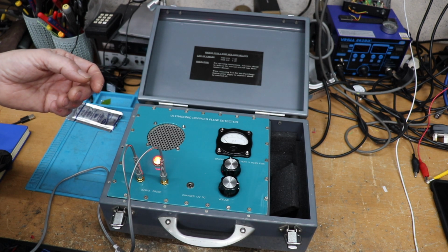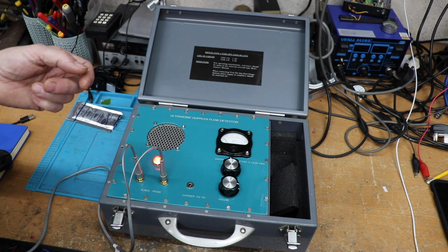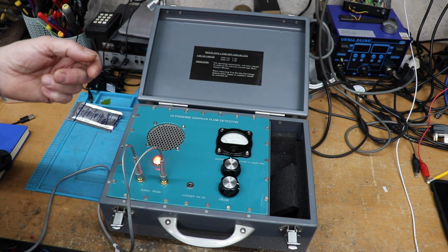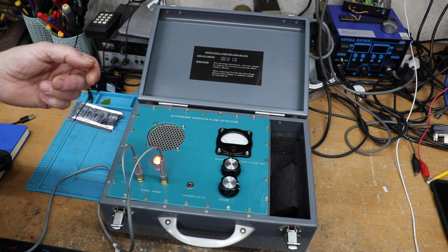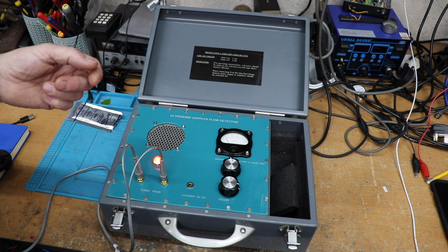Anyway, folks, that's my little Doppler machine, which seems to work pretty good actually. We might take it along to outpatients and ask one of the patients to volunteer to see if we can try it out. Yeah, quite pleased with that.